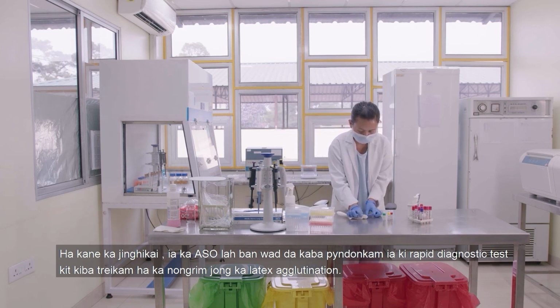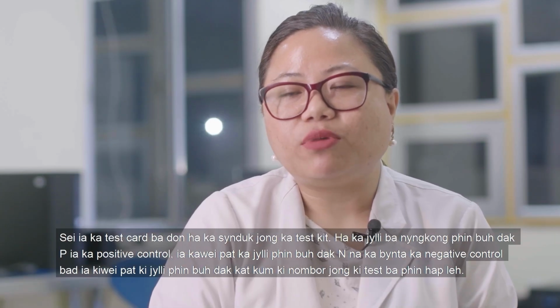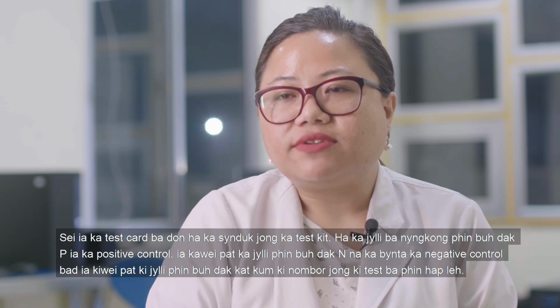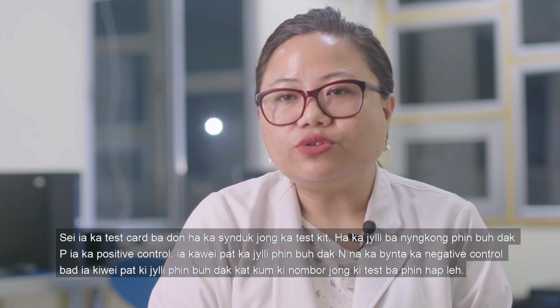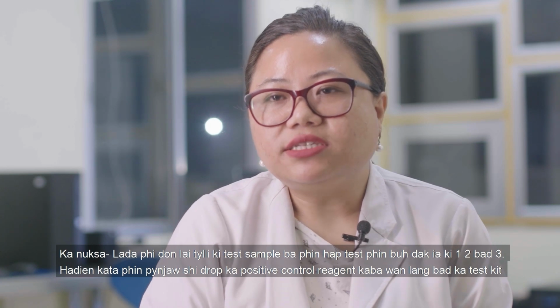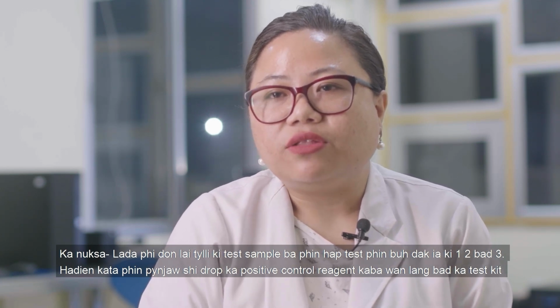Take out the test card that's present in the test kit box. In the first circle, you will label P for positive control, the next circle N for negative control, and the rest of the circles you will label as and when required according to the number of test samples that you are going to perform. For example, if you have 3 samples to test, you will label 1, 2 and 3.